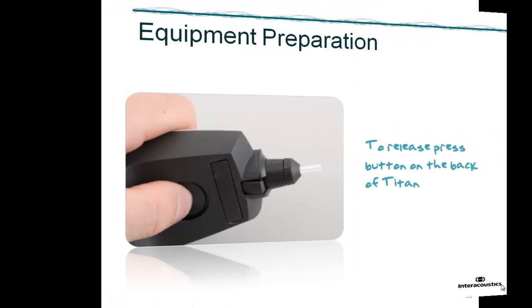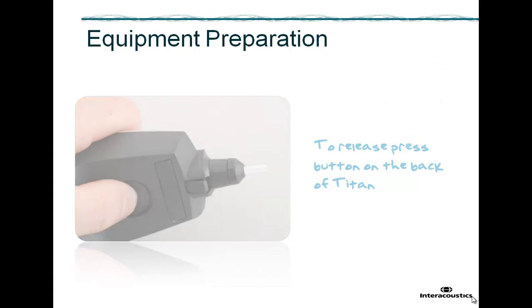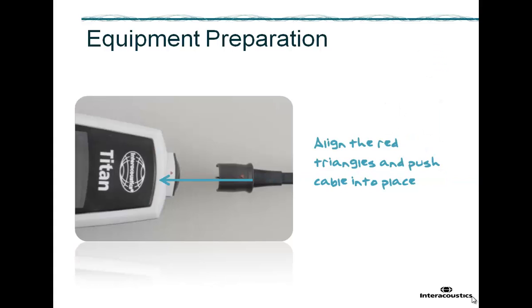To release the probe or cable, press the button at the back of the Titan and pull the probe or extension cable out whilst holding on to the base. Do not pull directly on the cord of the extension cable as this can damage the tubing connections. When attaching a cable, align the red triangles and push the cable into place.